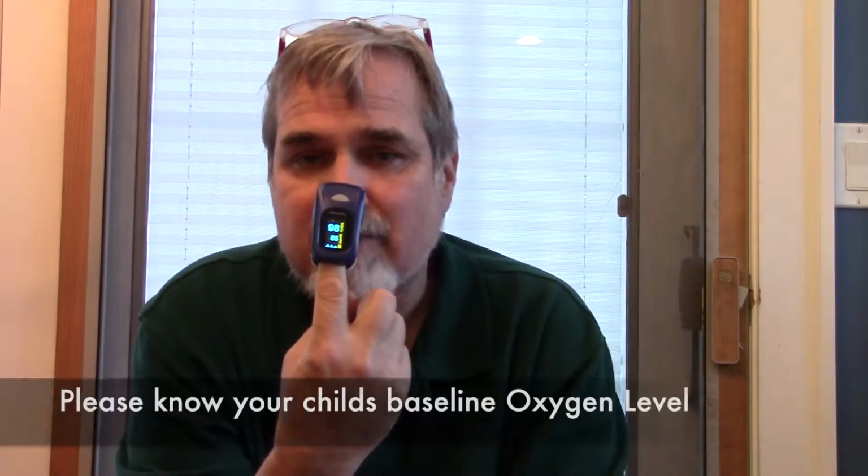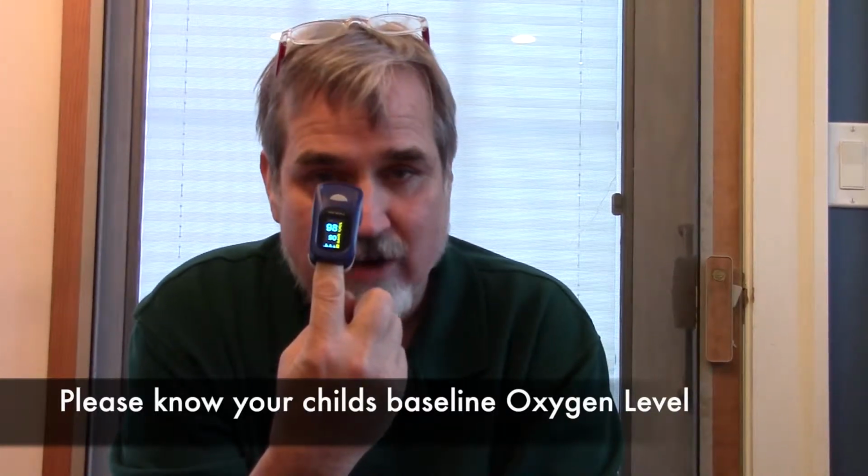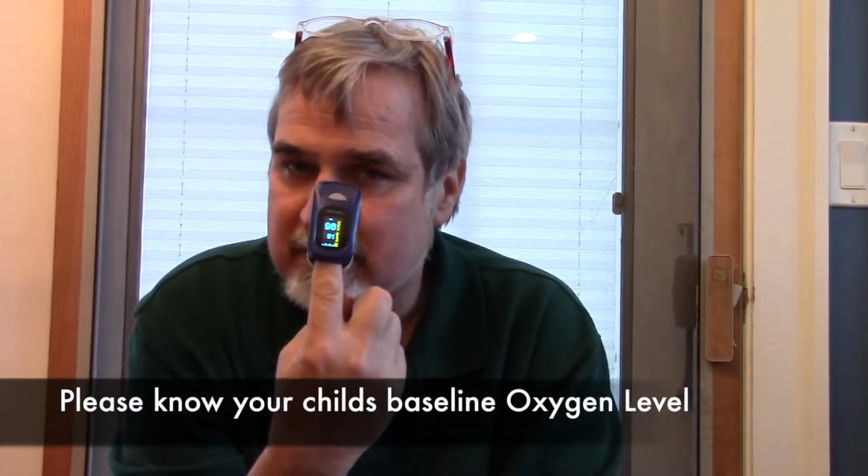Number two, have a baseline on your child. In other words, just try this when they're well and see what their baseline range is. Again, it should be over 94%. And always do a measure before you start a nebulizer treatment.